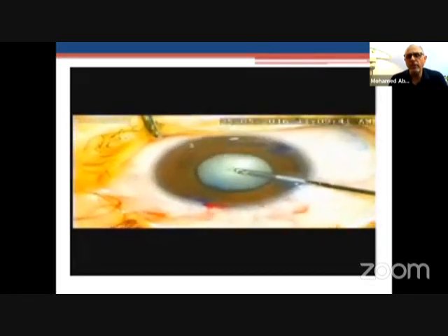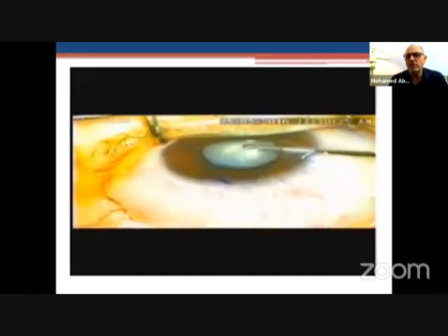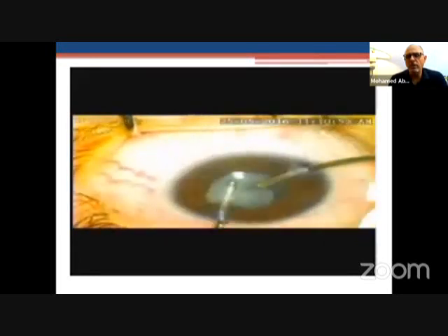Here is another child who, once I've opened the capsule, a lot of fluid came out. This is why I use an insulin needle beforehand, so that I can aspirate whatever is causing this positive pressure. And then you don't do a very large rhexis in these children, because it tends to run out the capsule. And hydrodissection or visco dissection, very soft, so you can remove it.